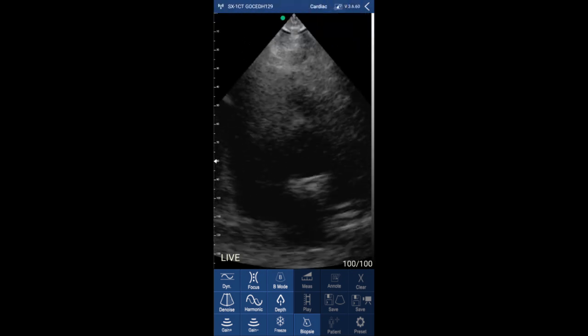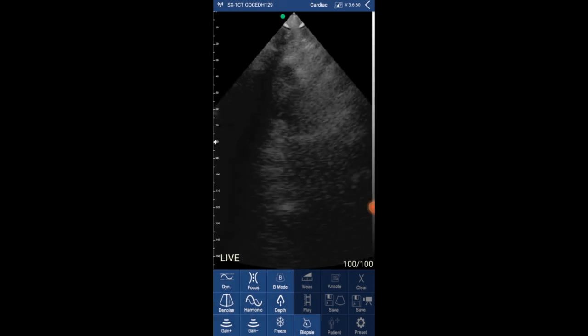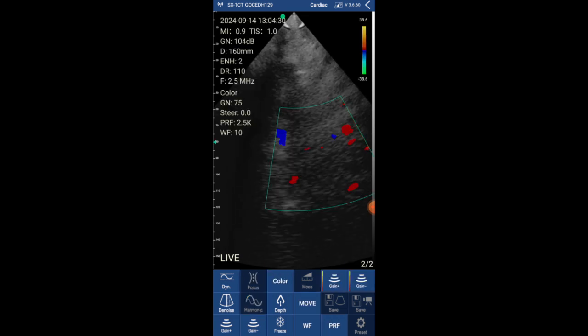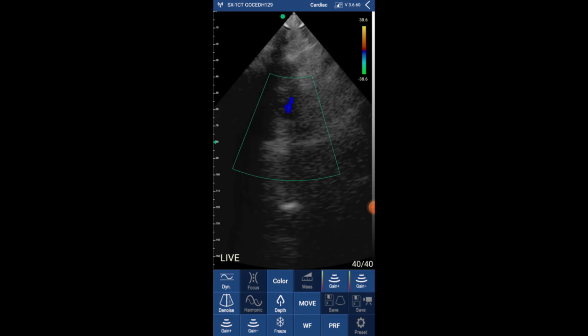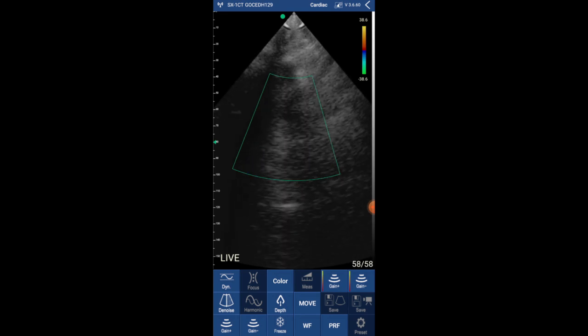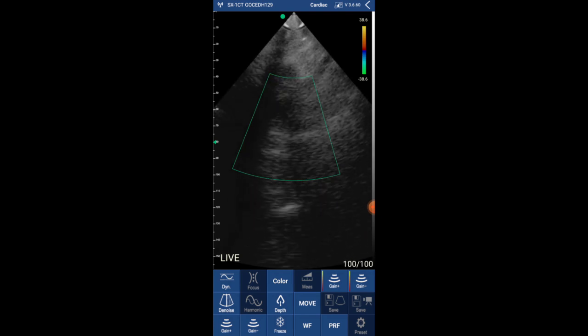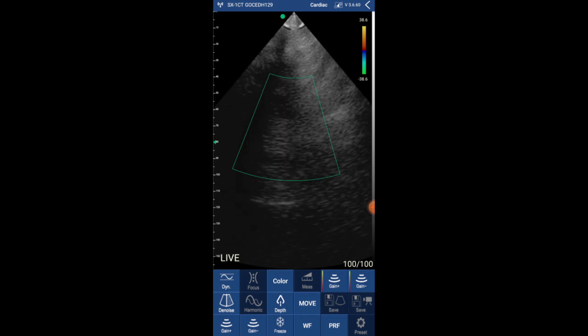It was challenging to obtain the suprasternal view because of the size of the scanner; however, I managed to obtain an image of the aortic arch with color Doppler as well. You can even move the baseline and increase and decrease the gain.